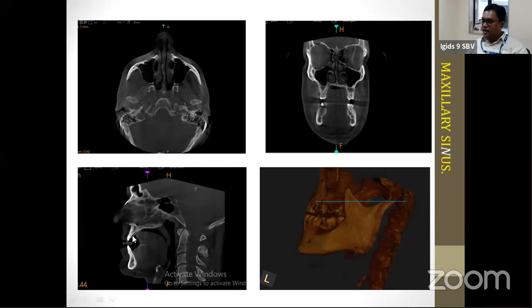In the side view, or the lateral view rather, to be more technically specific, we are taking a look at it as a sagittal view or the lateral view. In the lateral view, you are able to see the cross section of your entire hard palate here, the tooth, and this is the mandible. Once again, the buccolingual relationship of the mandible is very clearly evaluable in this view here, right? So this is for the maxillary sinus. Basically, I have sketched this here for the sake of the maxillary sinus.